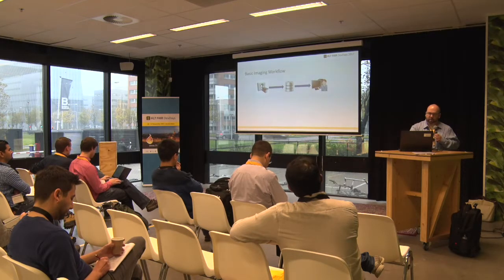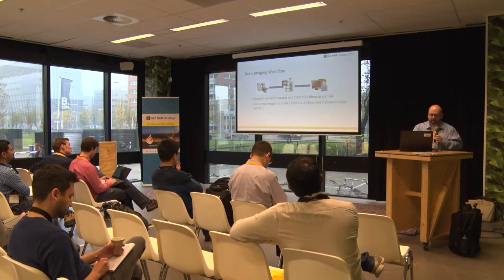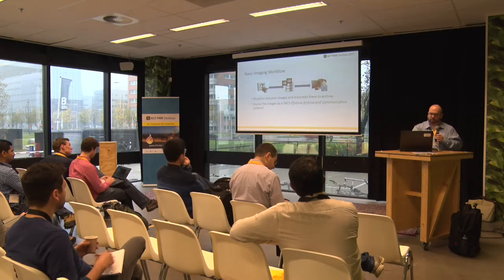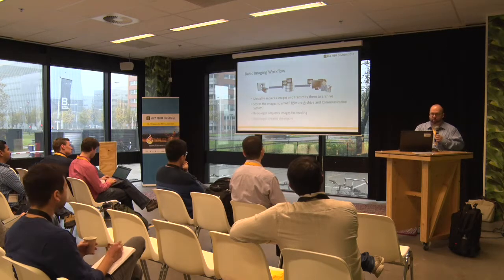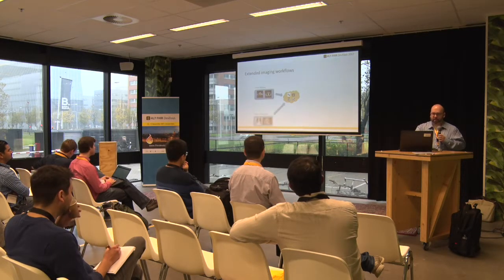Generally, in an imaging workflow, we acquire images from a modality, we transmit them to a PACS. The PACS, the Picture Archive and Communication System, stores the images, the radiologist requests the images for reading, and then they create a report. But it goes much beyond this. That's the very simple use case.